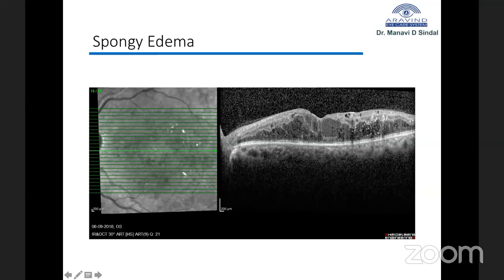And if you pay attention, there are some hyperreflective dots over here, because this is defined in terms of reflectance now. So these are what are called hyperreflective foci, HRF, or hyperreflective spots, something which is getting a lot of attention nowadays in AMD, RVO, as well as DME and its management, though nobody is very sure where they lead. These are small dots of equal reflectance to the RPE layer without back shadowing. The ones with back shadowing are supposed to be hard exudates, and they are not visible on the infrared or fundus photography or clinically.